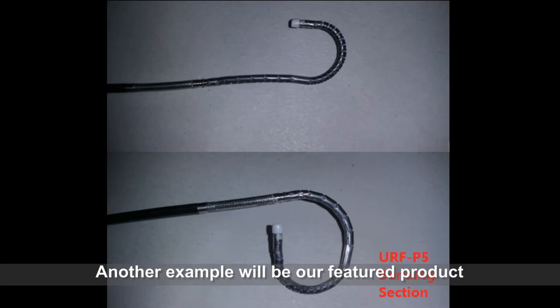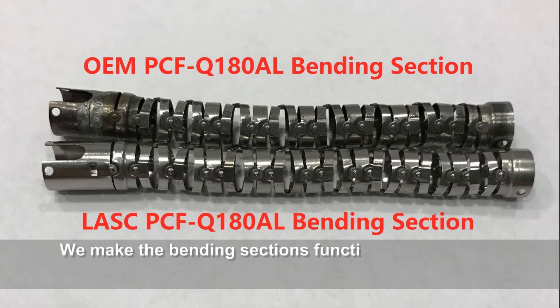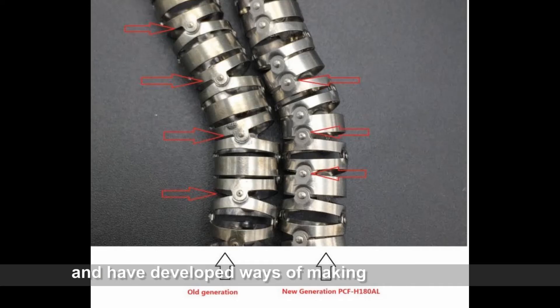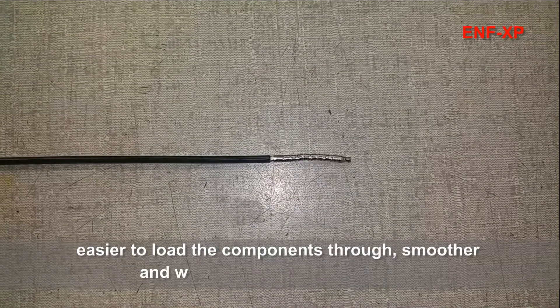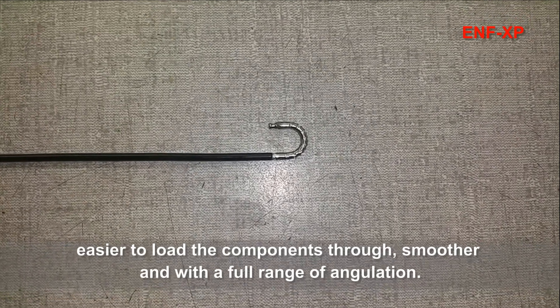Another example would be our featured product: bending sections. We made the bending sections functionally equivalent to the OEM specs and have developed ways of making them more robust, easier to load the components through, smoother, and with a full range of angulation.